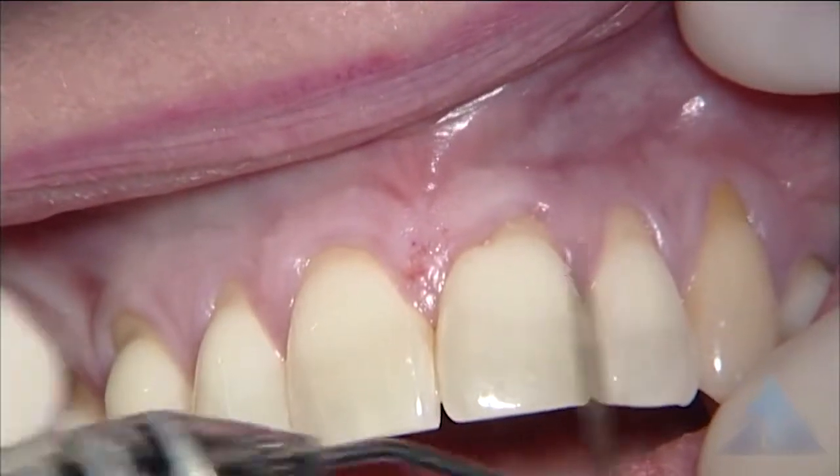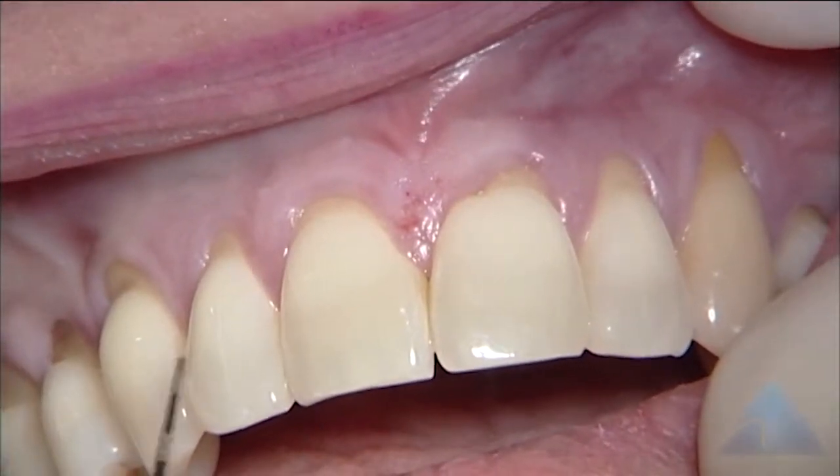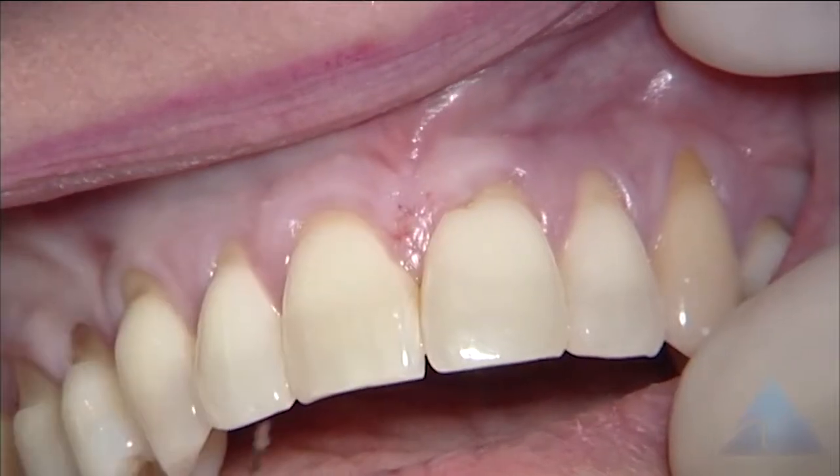So this is more aesthetic root coverage, and preventing sensitivity and root caries and so on. You can see a beginning staining area there — it could be a little staining area.